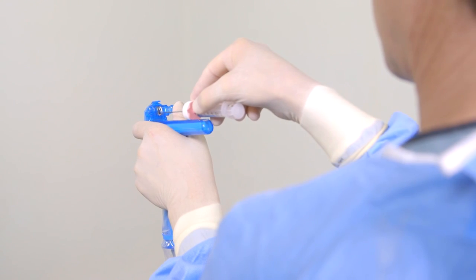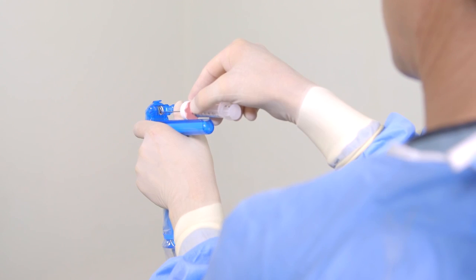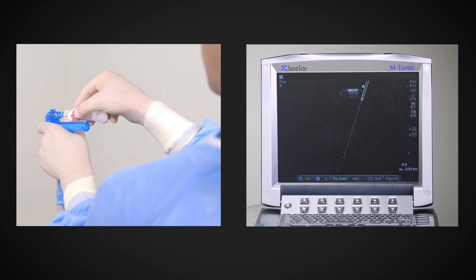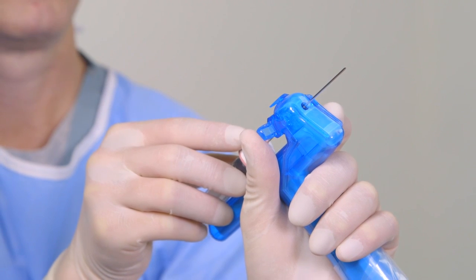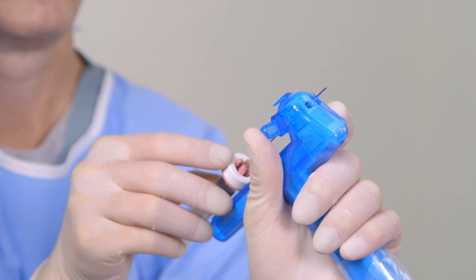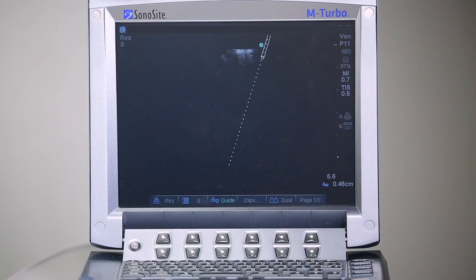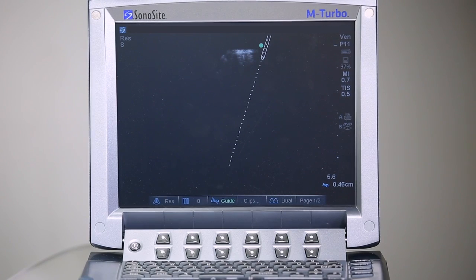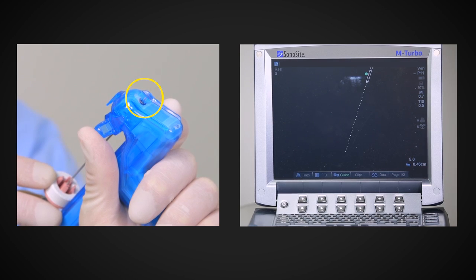To maintain needle sharpness, avoid hitting the needle tip against any surface as it is preloaded into the needle guide. With the needle in the guide, move the needle forward and backward. As you do this, confirm the needle movement is mirrored by the virtual needle movement on the sonogram. Now, move the needle until its tip is just protruding from the base of the sterile shield and confirm on the sonogram that the virtual tip is visible at the top of the sonogram. Observing that needle movement is synchronized and that the virtual needle tip is properly located on the sonogram confirms that the system is ready for use.